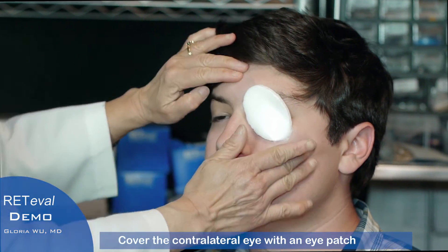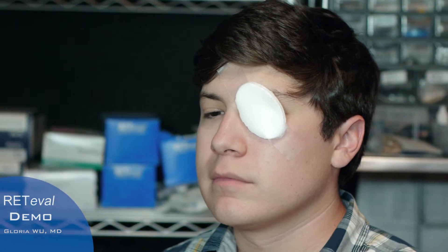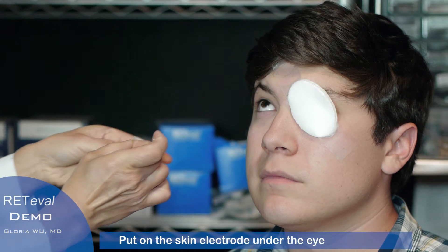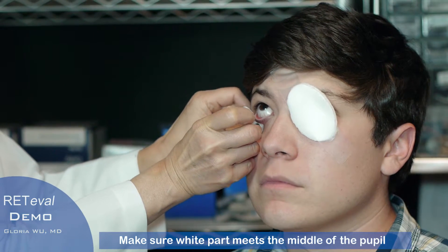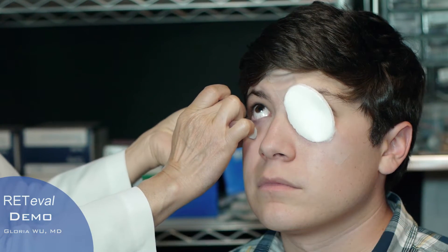Now we're going to tape the contralateral eye. We're going to put the skin electrode and make sure the white part here matches the middle of the pupil, lines up with the middle of the pupil.